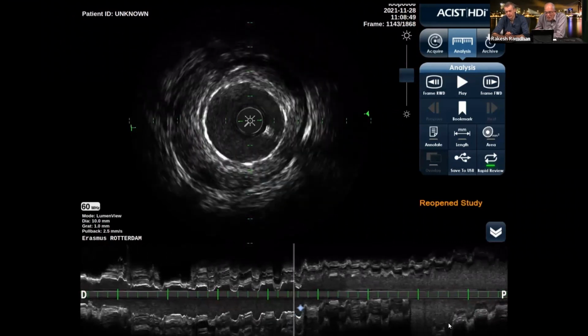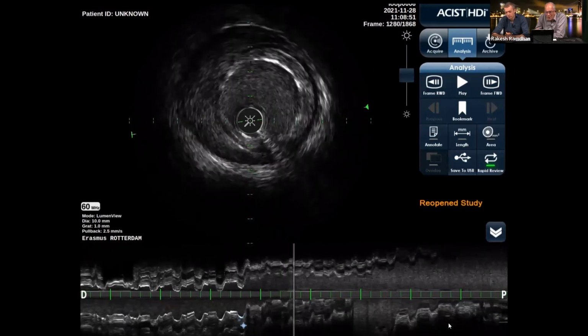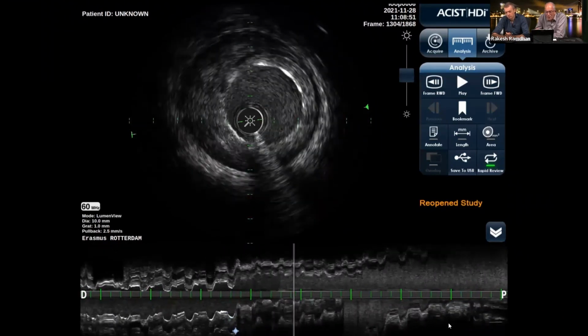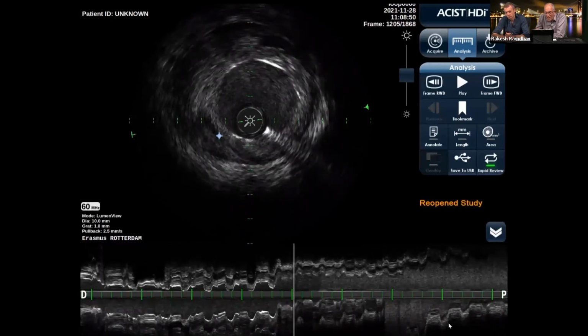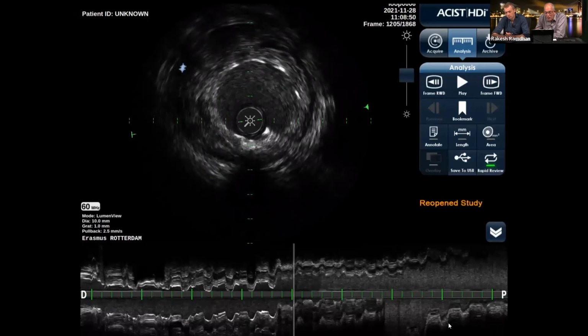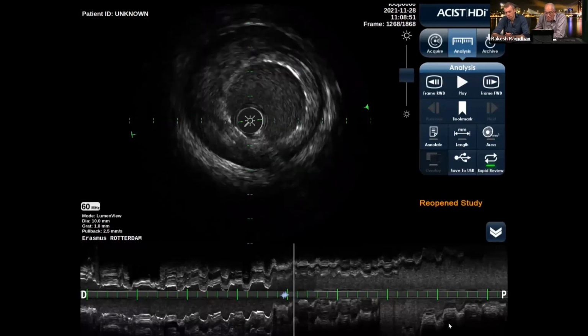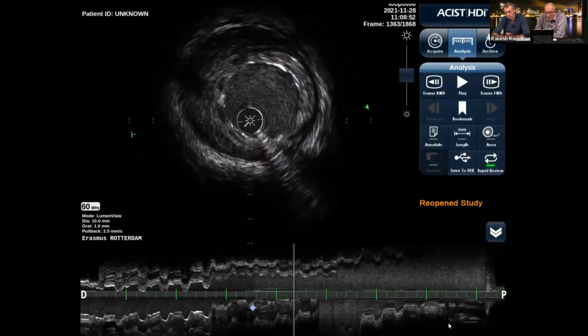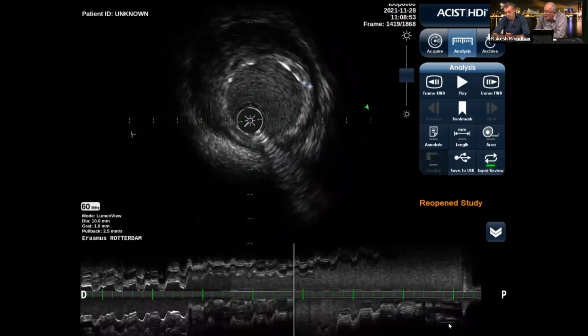And don't think this stent is by definition too small because it looks much smaller than the vessel. It's because this is not the real vessel. The real vessel you see in here. This has nothing to do with the real vessel. This will come back close to the media. And then what you see indeed is that he covered the ostium of the LAD.